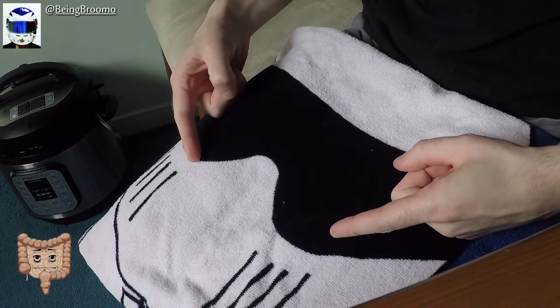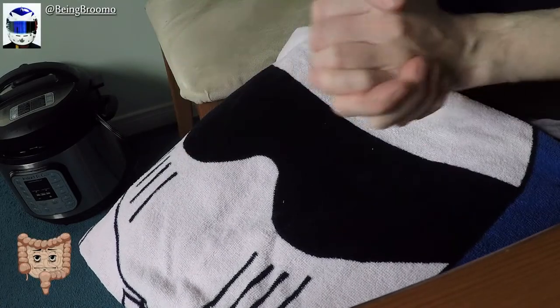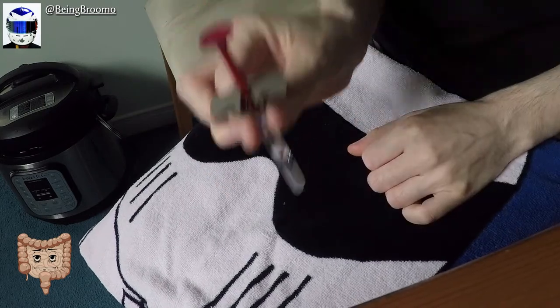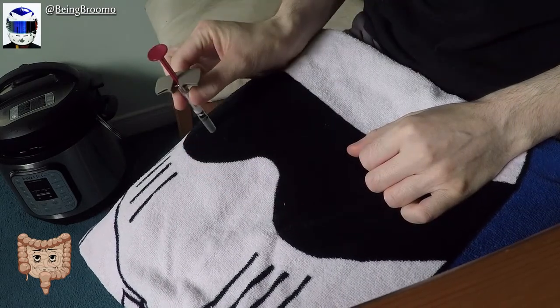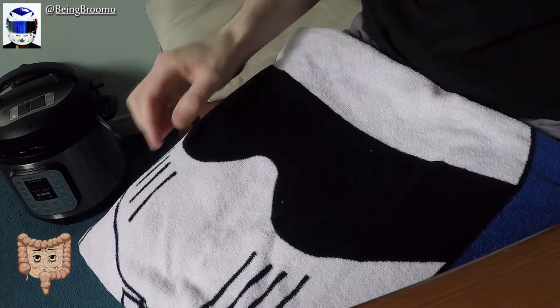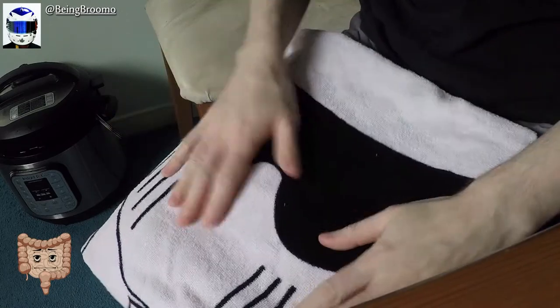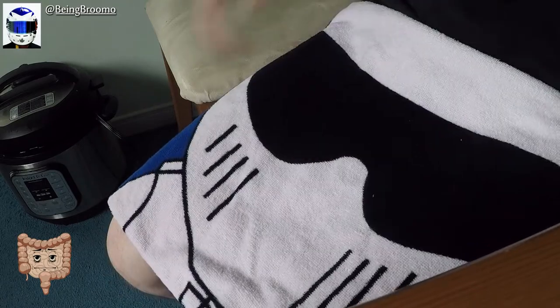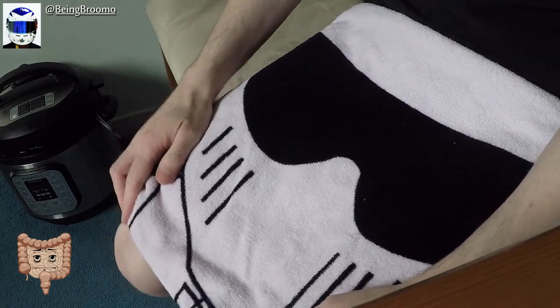Hello, being Bromo and not the Stig despite this towel. So what I'm going to do is I am going to inject this into my leg. But so that you don't have to look at me in my undies, I've got the Stig towel going on. And we'll see how this goes. This is my first time injecting myself.